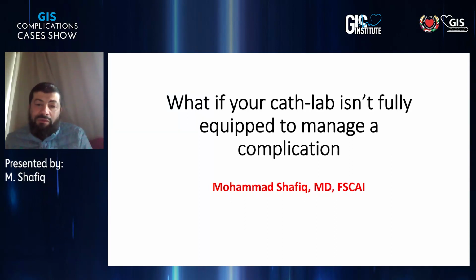I'm Associate Professor of Cardiology from Egypt. I will present today one of my cases in which I had a major complication, but my cath lab wasn't fully equipped to manage this complication. But thank God, I could manage it.